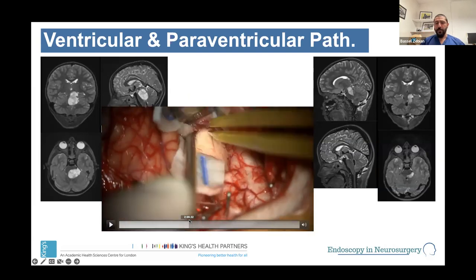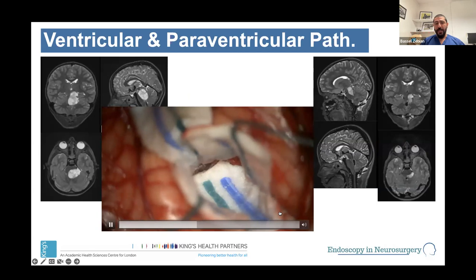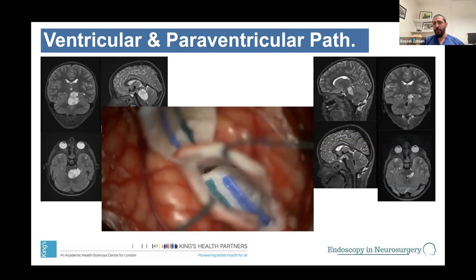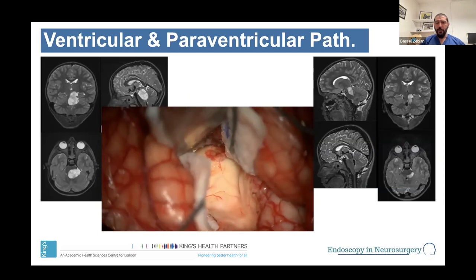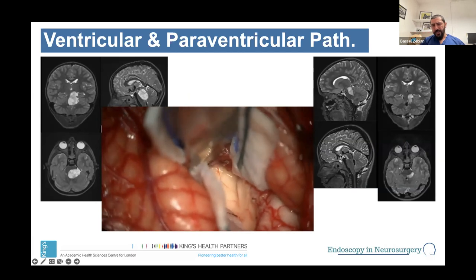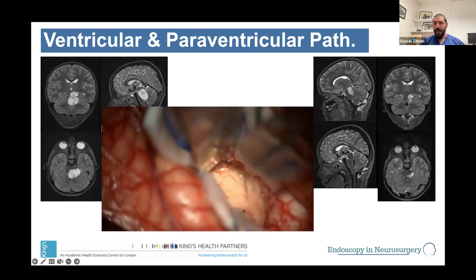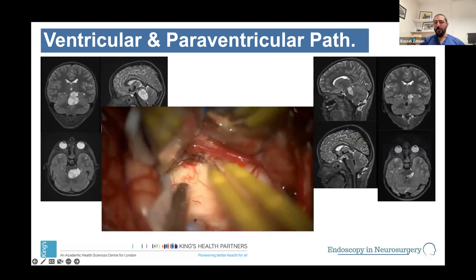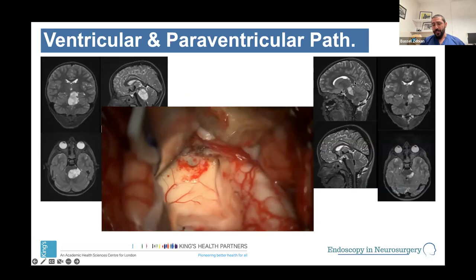Well, the majority of people, telovelar, I appreciate some people will go through the vermis. This is for a brainstem exophytic tumor, so a paraventricular tumor causing, not obstruction yet, but at risk of causing obstruction. And this was a pilocytic that we managed to debulk. In the midline sagittal, you can see very quickly, if you compare the parasagittal with the sagittal, how often people can make it look like you've done a complete resection when you haven't. This is a subtotal resection.